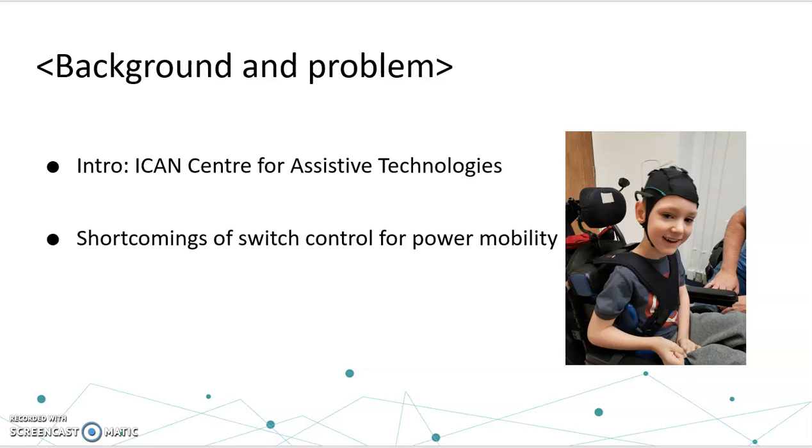power wheelchair. Something important to know about power mobility is that all power wheelchairs are made by different manufacturers. All the chairs have slight differences in drive controls, driving abilities, switch abilities, and motors and batteries. It's very important that we have some sort of solution that's a more universal solution that can work with a number of different power wheelchair companies.